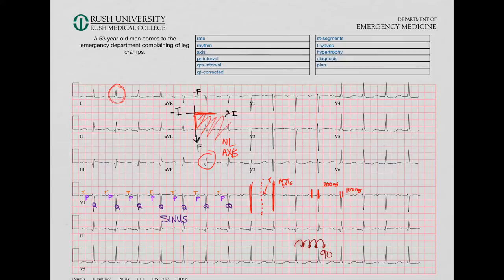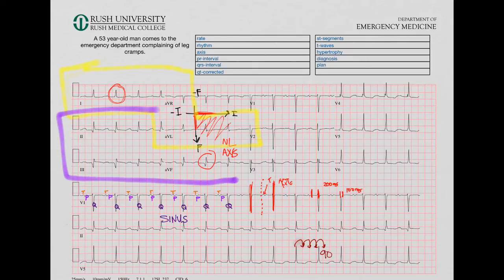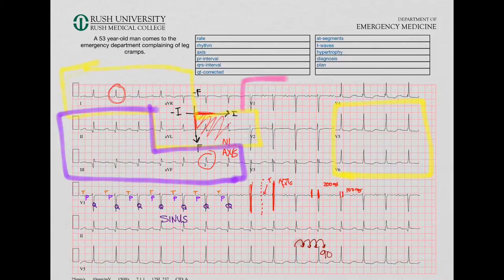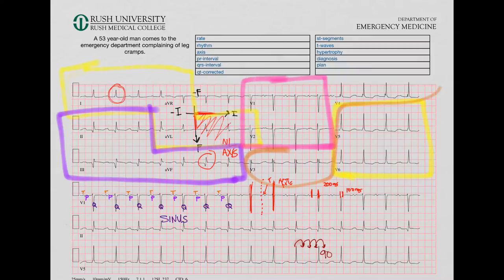Now let's look at the ST segments. First, our high lateral leads — leads 1 and AVL — the ST segments and T waves look great. Our inferior leads — 2, 3, and F — the ST segments and T waves look normal: T waves upright, ST segments flat. The lateral leads V5 and V6 also look fine. The septal leads look fine, and the anterior leads also look fine. So our ST segments and T waves look good.